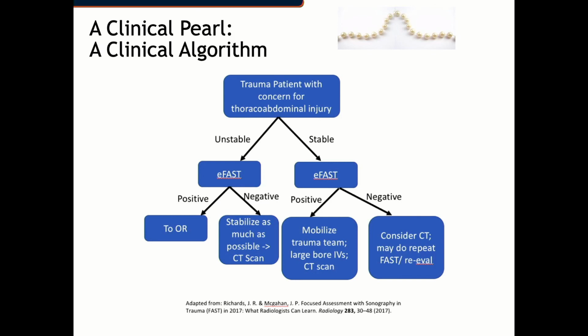All right, so I'm going to leave you with this second or third, perhaps clinical pearl, and it's just an algorithm for you that you may find helpful as you go into your clerkships and then further ahead into your residency. And in any of these scenarios, eFAST is a great way to start. There's no radiation involved, and it is very quick and very portable. So we encourage you to make that part of your regimen.